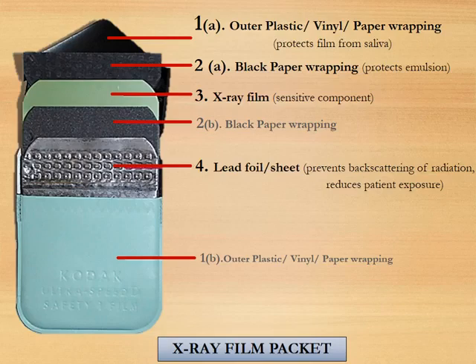Once you peel open the triangular flap, you will see all four layers. The outer covering, including the triangular flap, is made of plastic, vinyl, or paper and forms the first layer of the x-ray film packet. Since it is on both sides, it is marked as 1a and 1b.